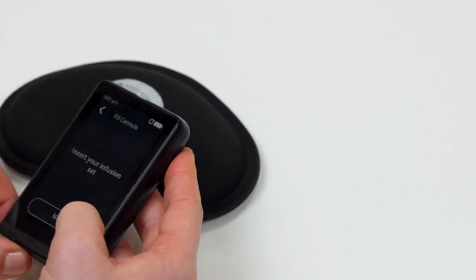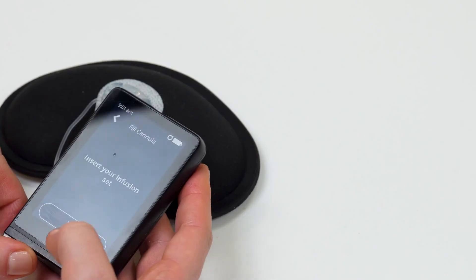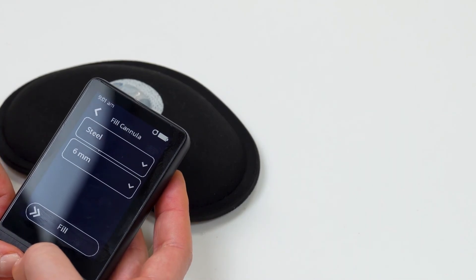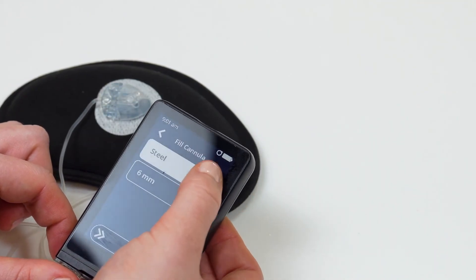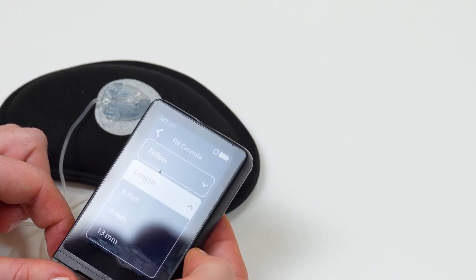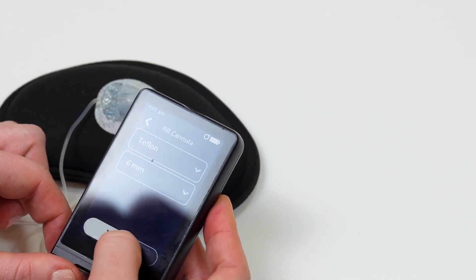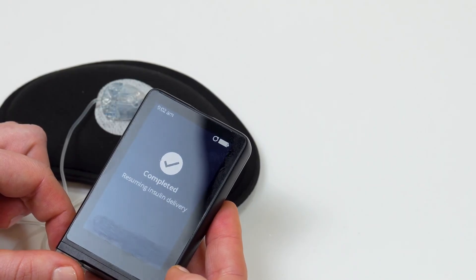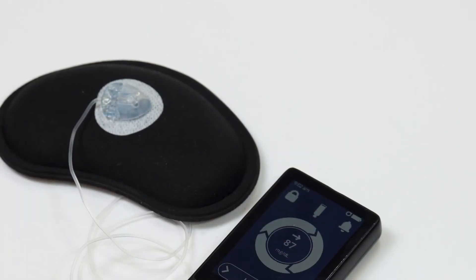Unlock your eyelet device. Tap next to confirm you have inserted your infusion set. The inset uses a Teflon cannula. Select the Teflon cannula and six millimeter cannula length. Swipe the fill slider to the right to fill your cannula with insulin. This will not deliver extra insulin — it will deliver insulin to fill the space where the inserter needle was. It will also log the infusion set change and remind you when it is time to change your infusion set again.